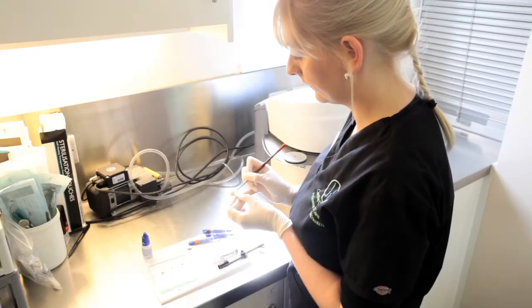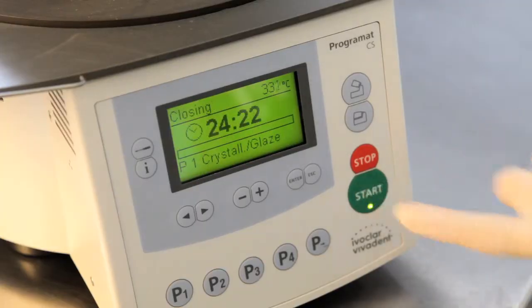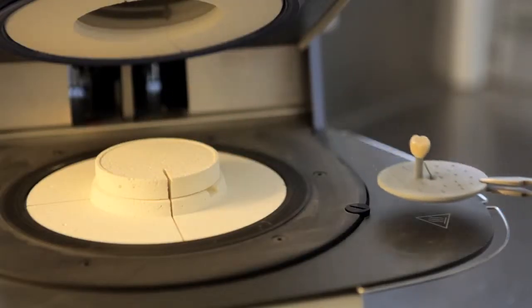From there, it's stained, it's glazed to make it look whole, beautiful, and just like the natural tooth. The tooth is then fitted and the patient can walk out on the same day with their crown.